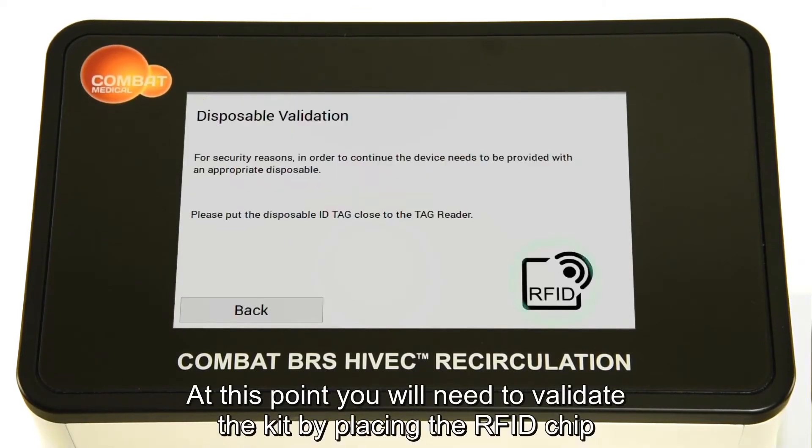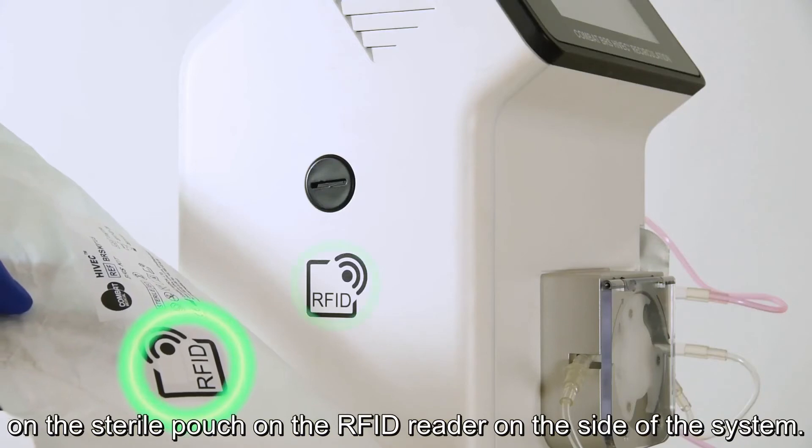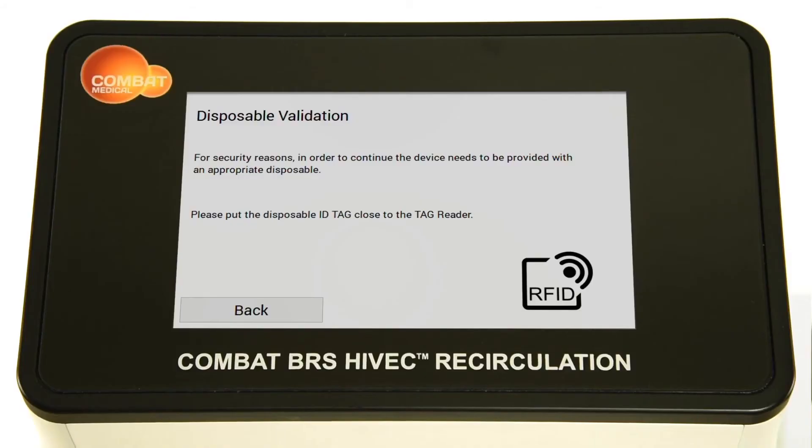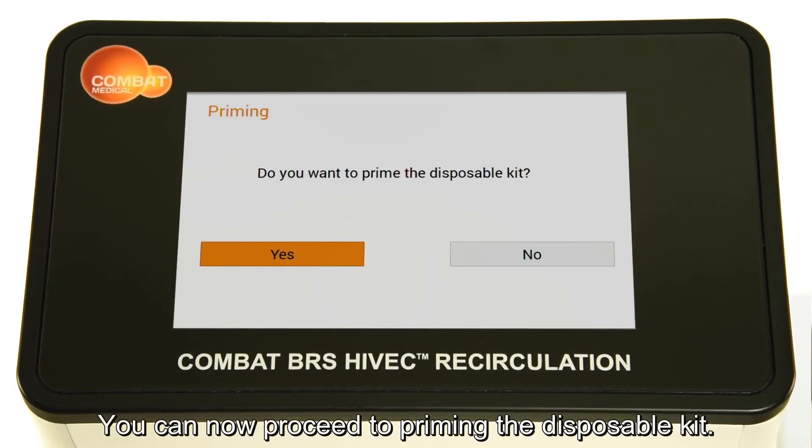At this point, you will need to validate the kit by placing the RFID chip on the sterile pouch on the RFID reader on the side of the system. You can now proceed to priming the disposable kit.